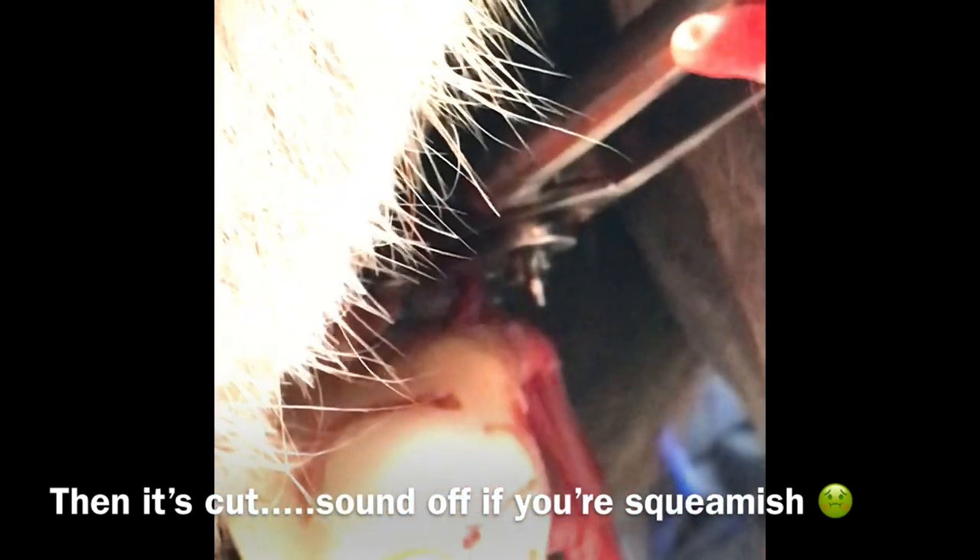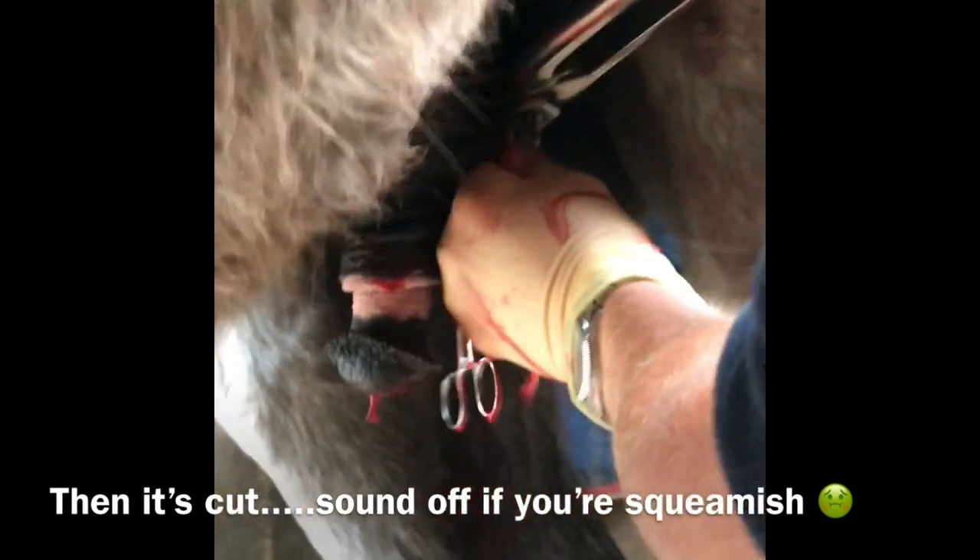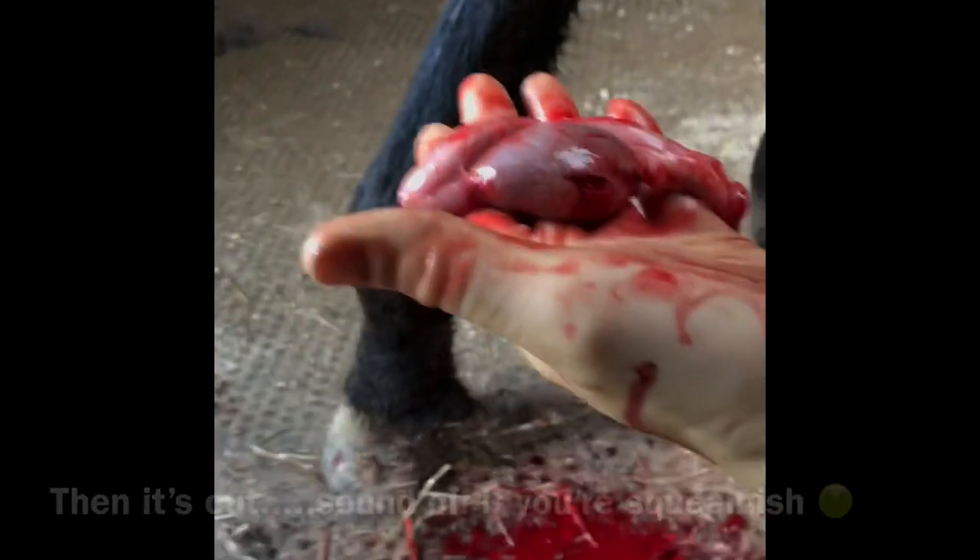You need to make sure that it's covered everything, so you know it's got everything there. Then that has got it, it's just caught in there. There they are.